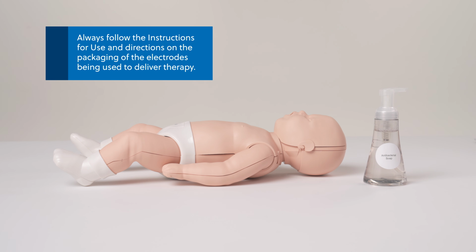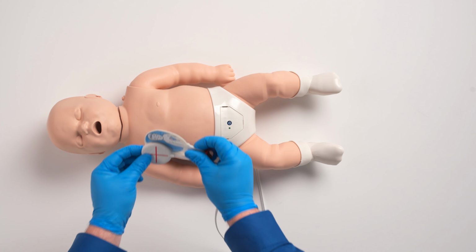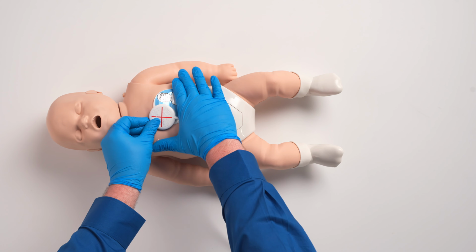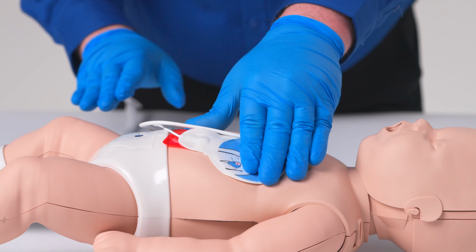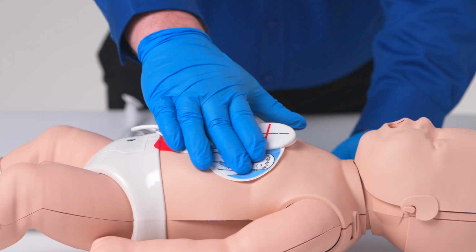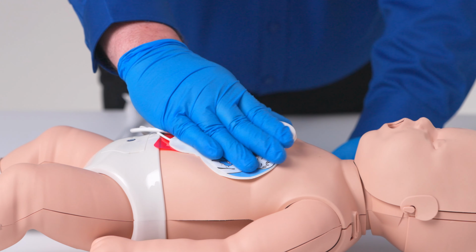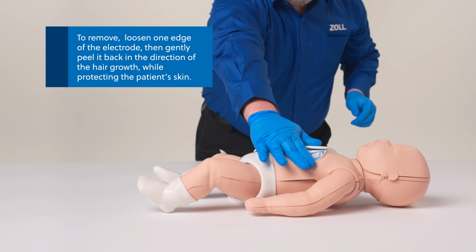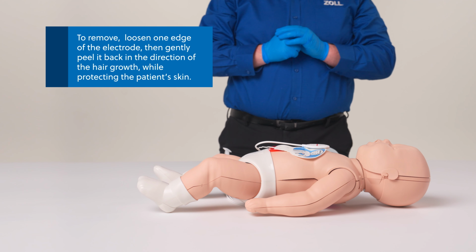Ensure that the patient's skin is prepped before placing electrodes. Place the electrode by pressing one edge of the electrode first and then rolling the remainder of the electrode across the prepared skin area. Next, eliminate as many air pockets as possible. Beginning at one end and finishing at the other, use even pressure to smooth the electrode.